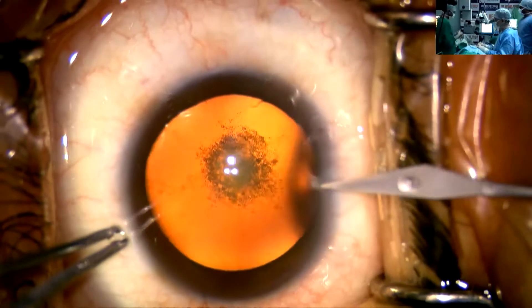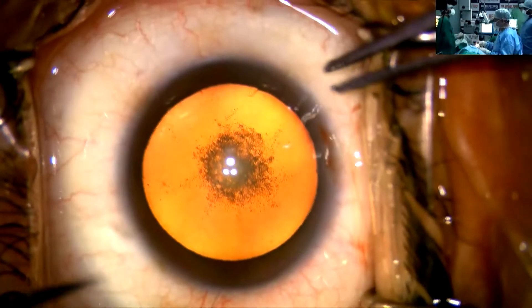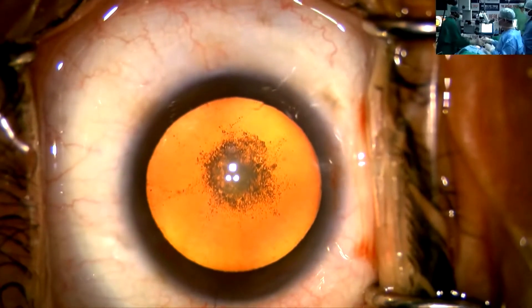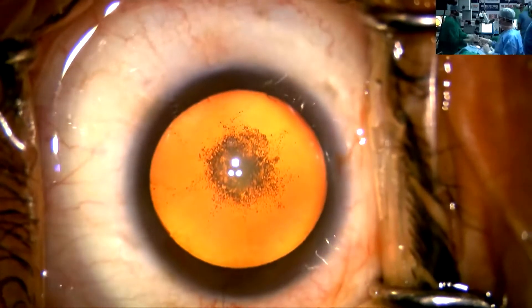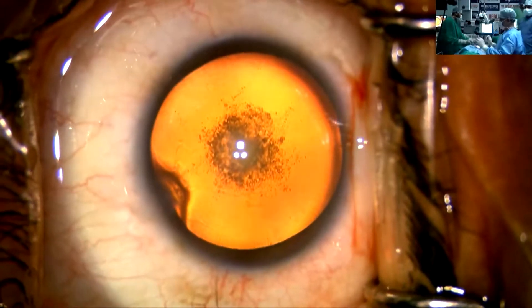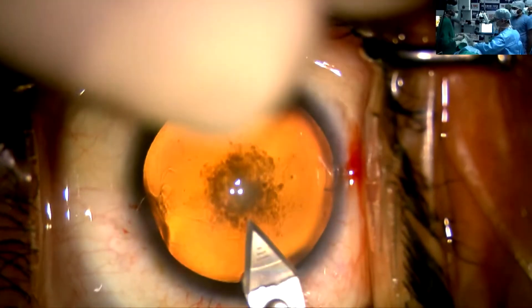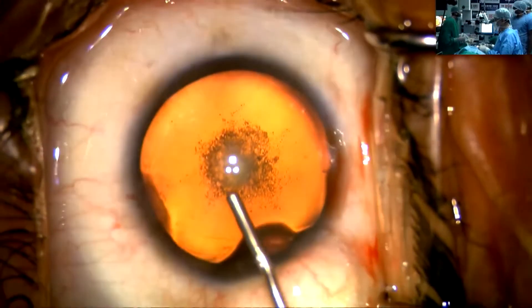I will be talking more about the machine as we go. I will be using some xylocaine adrenaline — she is a young patient, and although this is topical anesthesia, a little bit of anesthesia comforts the patient a lot. So I will be putting in the viscoelastic, now making the main entry. The blades I am using — Oro Lab has made these ultra-fine blades, comparable to the Alcon blades, and I am very comfortable with these now.